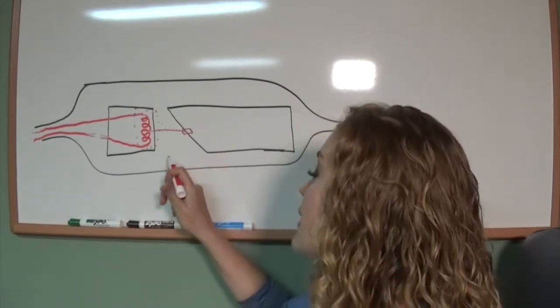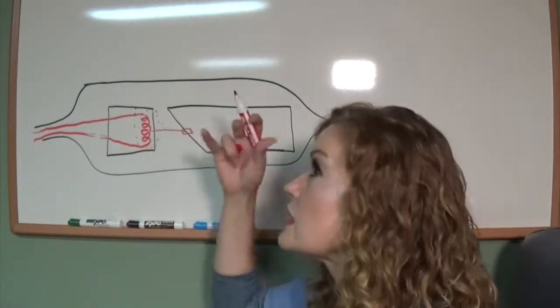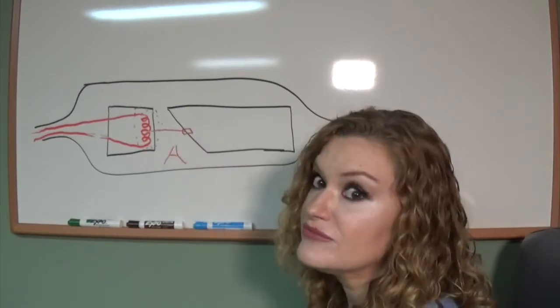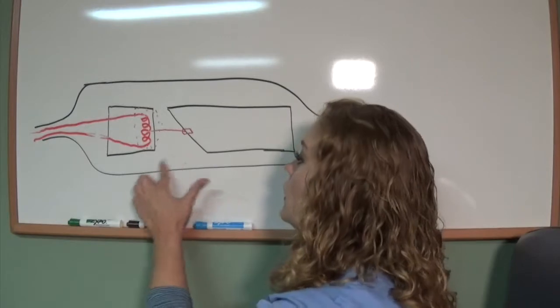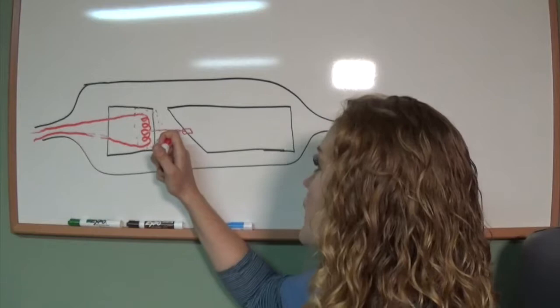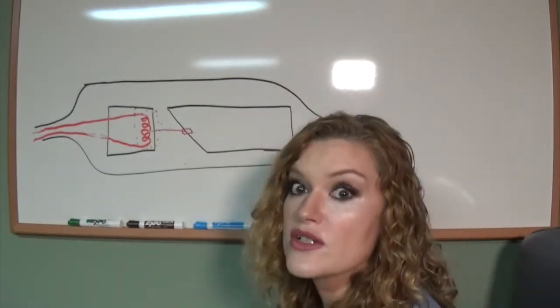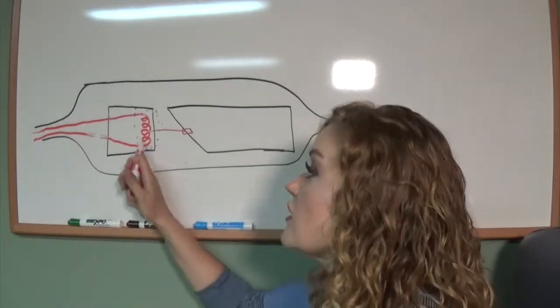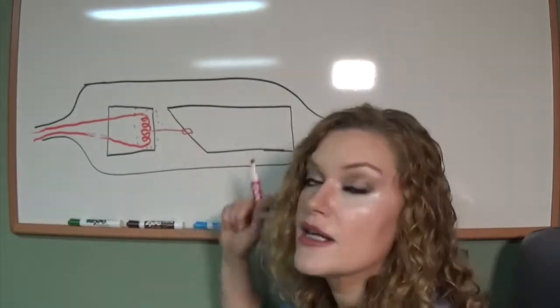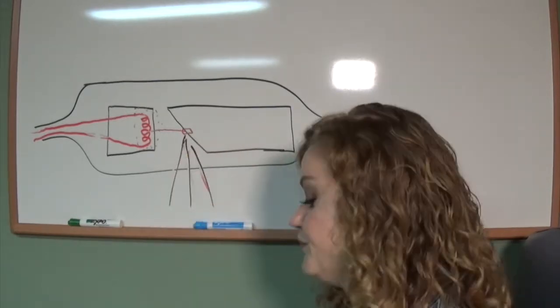And I always remember this as an anode because, since I'm a visual learner, I can visualize what it looks like, and the anode's kind of shaped like an A. I know it's stupid, but if it helps you. So, back. The electrons are going to come shooting over and hit the anode target. And then right here is where the X-rays are actually produced. This whole situation is just electrons coming into contact with the anode target, and that is where X-rays are produced. And then depending on the angle of the anode, they are going to shoot down.